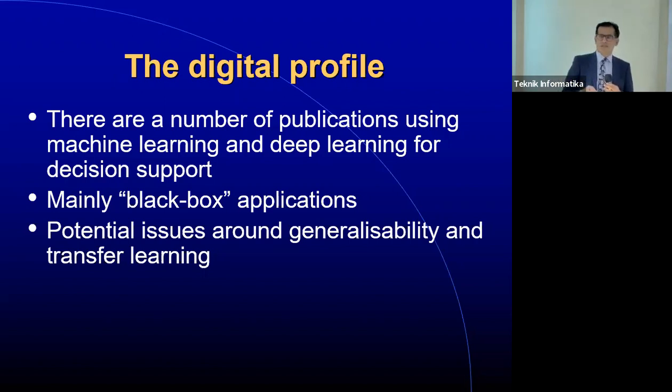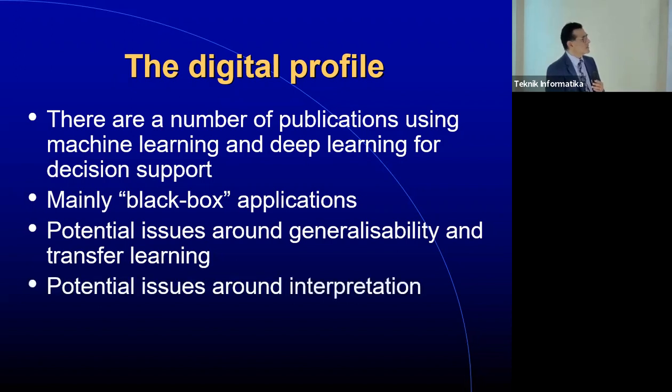Again, you'll know more than me, it's whether you can use the algorithms for identifying malignancy in one tissue type, whether the same ones apply in a different tissue type. With human beings, as we learn our pathology, there is this transfer learning because you get an understanding of what malignant cells look like. And so when you see malignant cells in one context, the features that they have in a different context are usually similar. So as human beings, there's a lot of transfer learning. What we learn in one tissue is applied to another tissue, but it doesn't work quite as well with the algorithms.